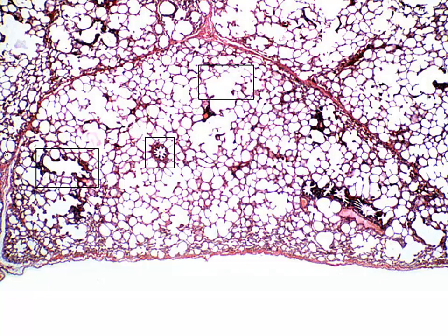Well, we can see in this particular slide how we have this lobule of our lung that is completely isolated with this connective tissue. So within the lung tissue itself, we are going to be segmented, and this is a lobule of the lung. We see many alveoli, but now we see these structures. At this magnification, I don't see any cartilage, so now we are talking about a bronchiole. And again, what level of the bronchiole we're at, we're not exactly sure, but we know it's not a bronchus because we don't see any cartilage.